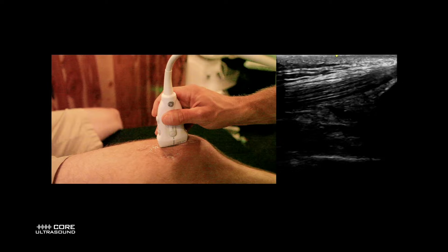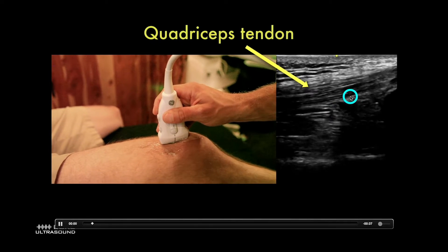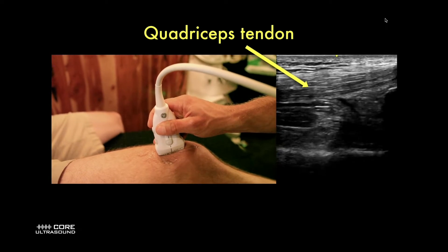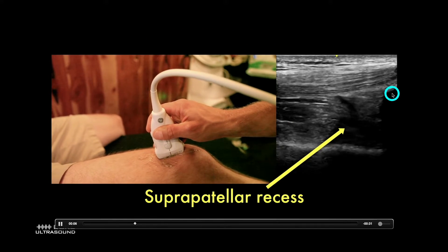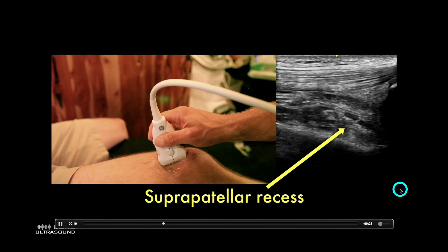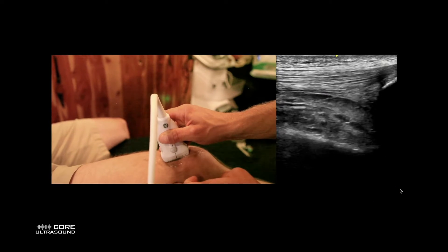I usually start by just looking for an effusion, and I found that the easiest place to look for it is in the suprapatellar area. I have my probe marker facing up, and I'm going to find a couple of tendons here. This one right here is the quadriceps tendon — you can see that it's attached to the patella. Deep to that, we have the suprapatellar recess, which is where fluid often accumulates.